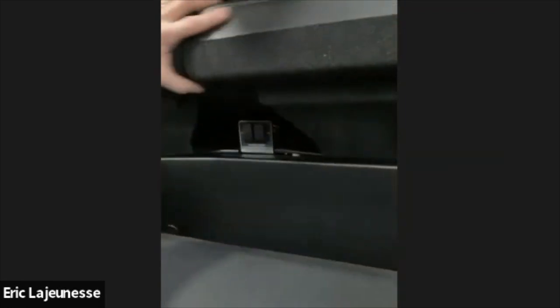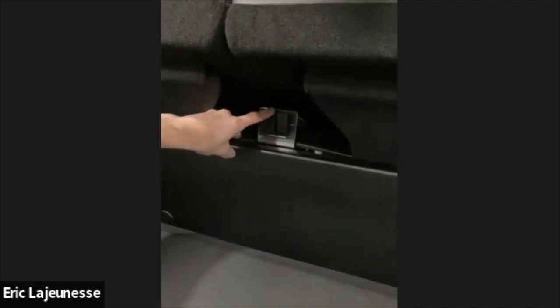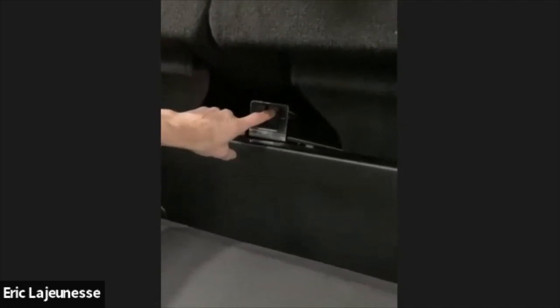So this is the bench seat right over here, and it says kneel up and ramp. So we'll say you hit the button and the ramp doesn't come in. If you hit this button, you can hear it, and it's getting the vehicle to come up now. So that's bringing your kneel system up, Brian. It says kneel up. So look at your vehicle. You'll see underneath the bench seat, right? You'll probably have to take the footrest down like this, but then you hit the kneel up, and then this will actually even bring the ramp up as well.